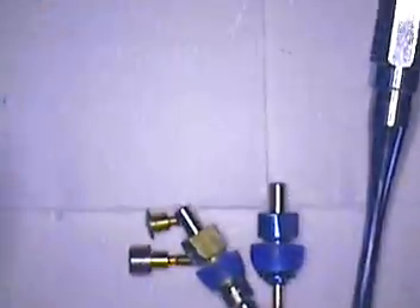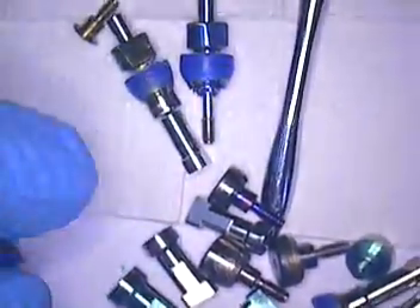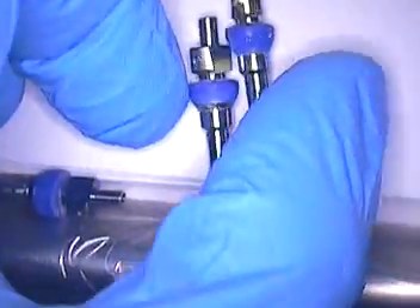I've got seven implants to do today, so here they are. Here's one, here's two — they're all different color codes. Here are the rest of them. Yellow. I have four yellows, two blues, and a green. Here's the other blue.